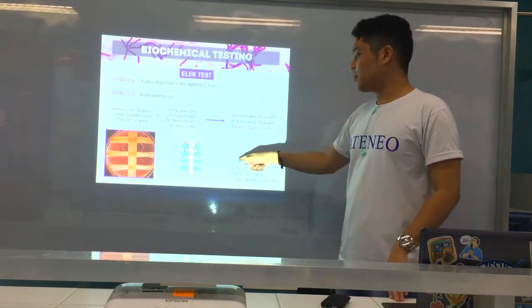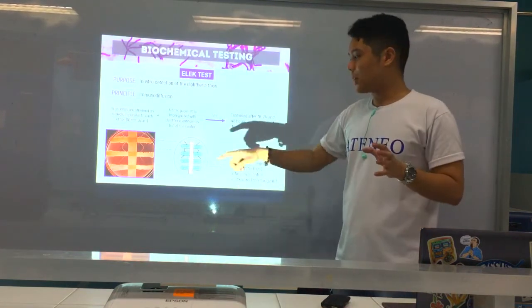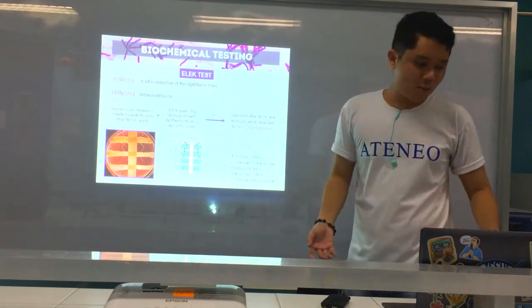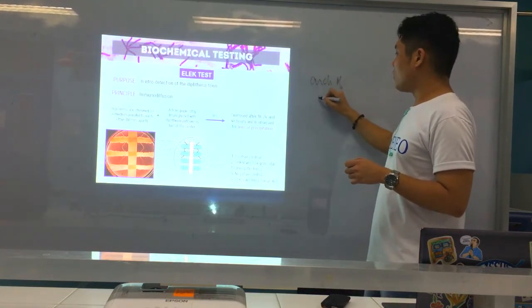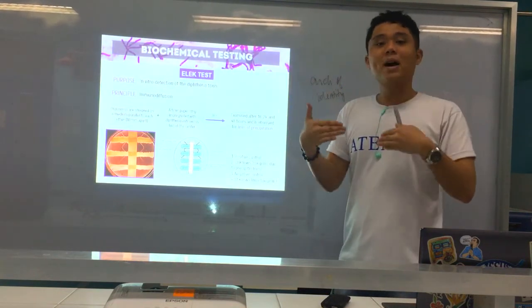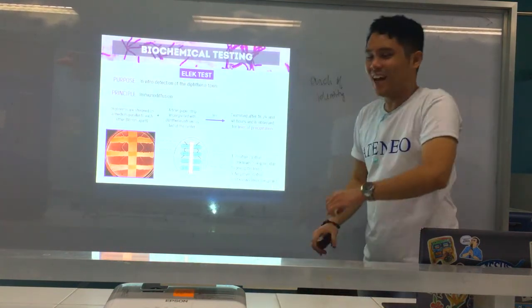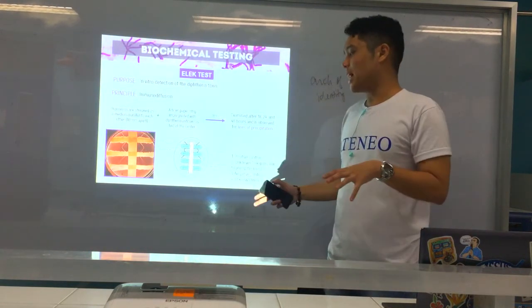Now, for number 2, example is the unknown organism. Okay, so therefore, ni-release man siya og precipitin lines. What happens? Ang precipitin lines sa 2 og 1 mag-connect. Okay, and that is what we call the arc of identity. So meaning, they are of the same arc of identity, meaning they are of the same toxin. Because ni-combine man sila, it means they are of the same substance that creates the toxin.